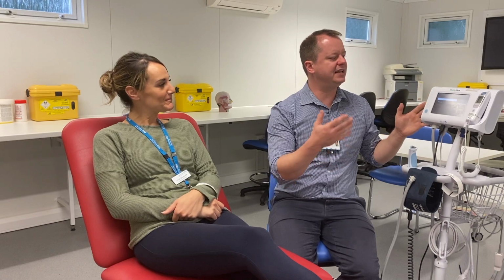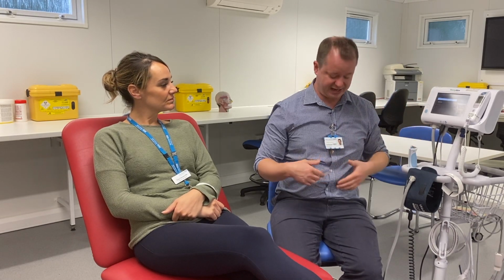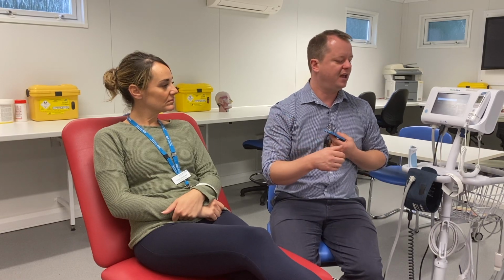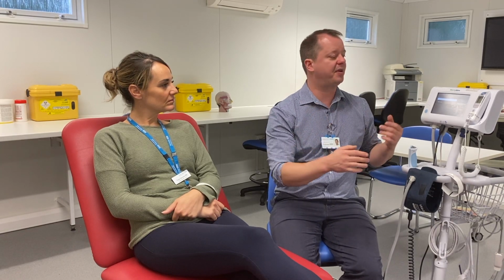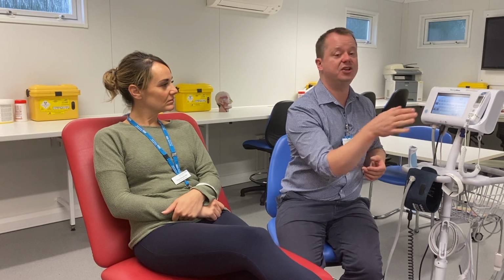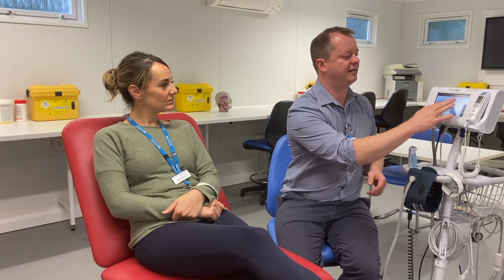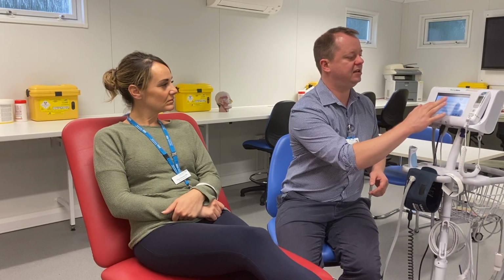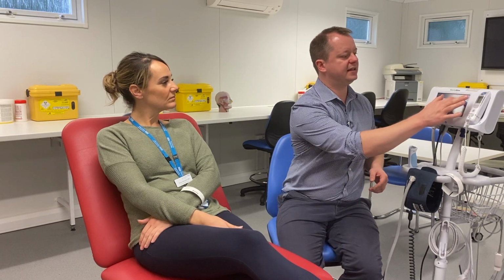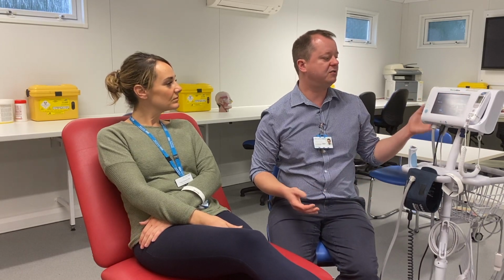This OBS machine you need to sign into first. If you're really fancy like me, you get a little barcode to scan, which you probably won't. But if you don't have that barcode, you can put in your username, which you'll be given when you start here. So my username is TOW. Once you've done that and signed in, it will then ask you what you want to do.